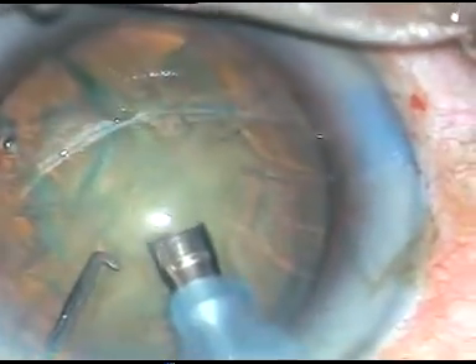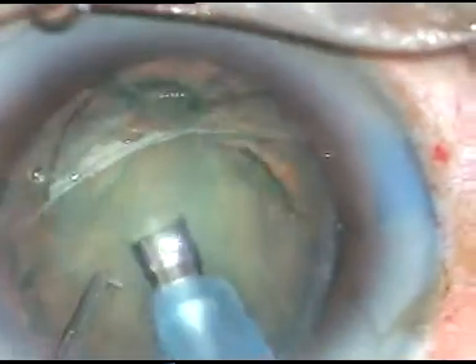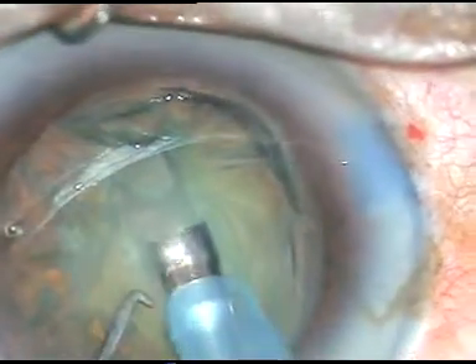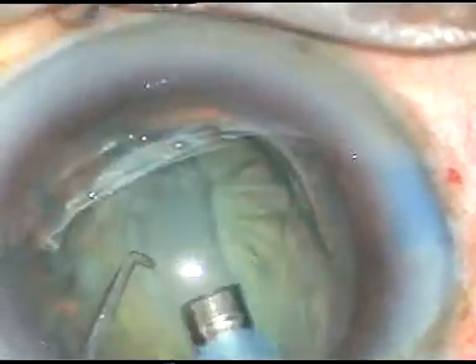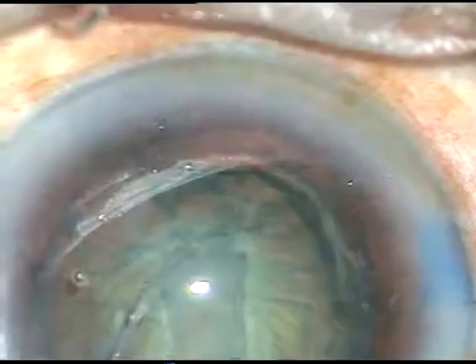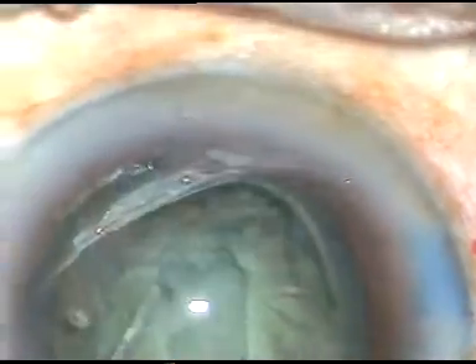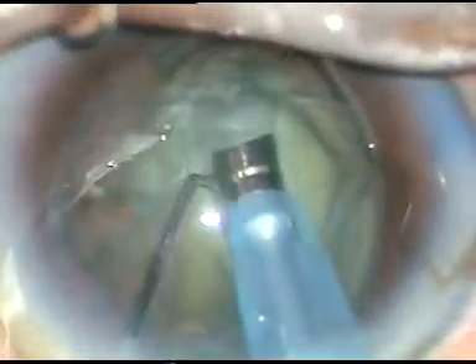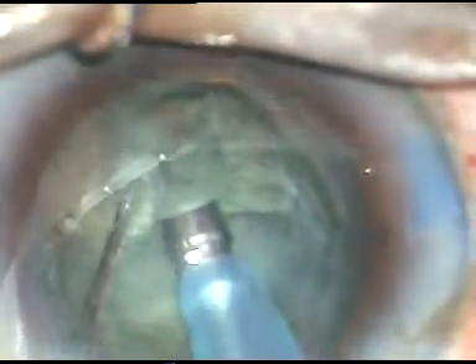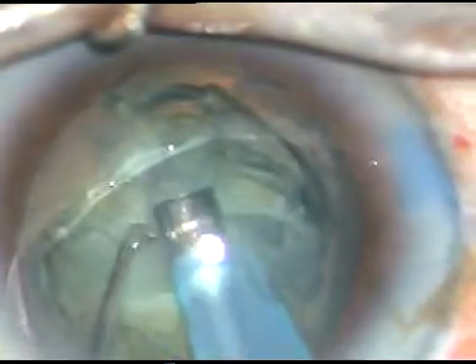In this case, I am going to make a trench from 11 o'clock to 5 o'clock. This first trench is slightly wider than the diameter of one tip — just a little more than 2.8 millimeters wide. After going to some depth, I rotate the nucleus. I then make another trench at the center of this hemi-nucleus, and the initial trench is deepened on this side. The trenching is done in FACO1 mode.